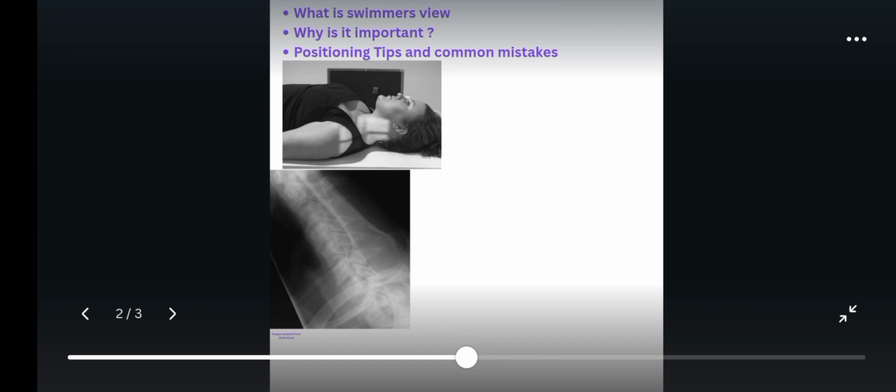In trauma cases that involve the spine, that is the cervical and thoracic region, the C7-T1 junction is particularly susceptible to injury. So there is a high risk of that joint having problems during trauma. In a normal lateral cervical and thoracic X-ray, the shoulder, especially in a patient with dense muscular shoulders, obscures this joint, so you don't see it clearly.